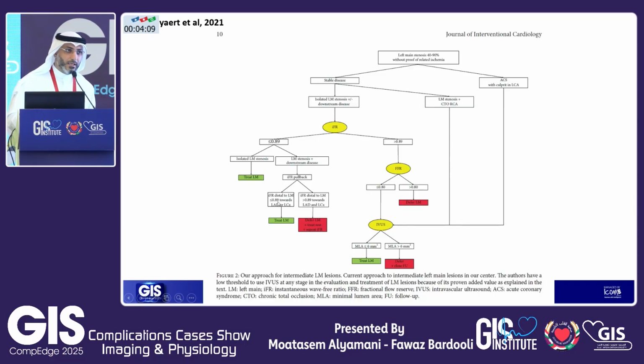However, as nicely demonstrated in Hani's case this morning, this is not perfect, because sometimes you treat according to iFR and then your left main or ostial LAD disease becomes positive. So you just keep that in mind.